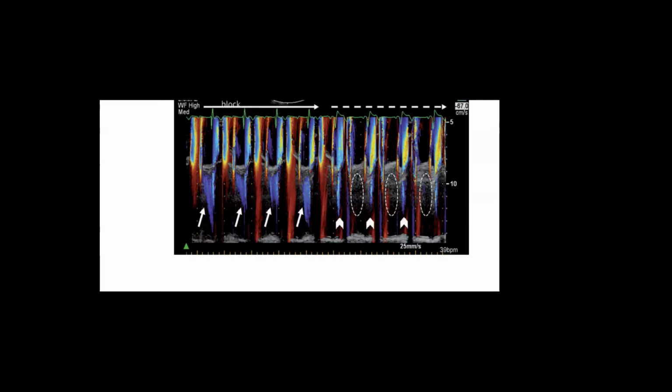Systole. No, if you look at the MR which is here, this MR, the color M-mode shows you the time relationship even better than 2D color. So here I'm seeing the MR. That's the MR. But when you time it, when you go into the ECG, that is not a systolic MR, that's a diastolic MR. So I have the diastolic MR.